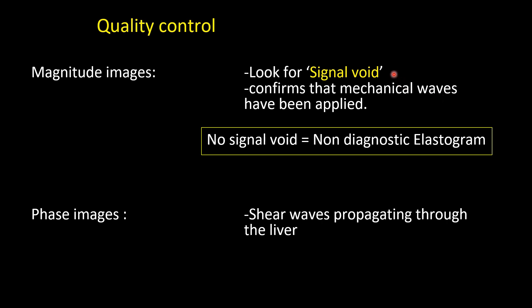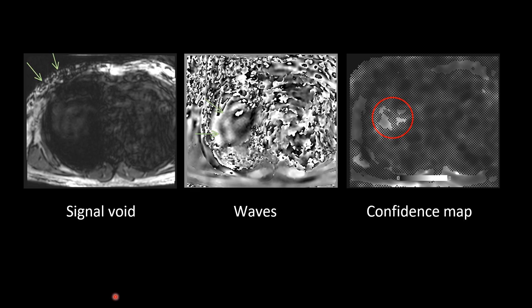Normally the signal void should be present, and if it is not present, the elastogram is non-diagnostic. We can see the shear waves propagating through the liver in the phase images. In the magnitude images we look for the signal void, and in the phase images we look for wave propagation. In this example, the distortion of the signal where the passive driver is applied is called the signal void, and you can see propagation of the waves through the liver parenchyma in the phase image.